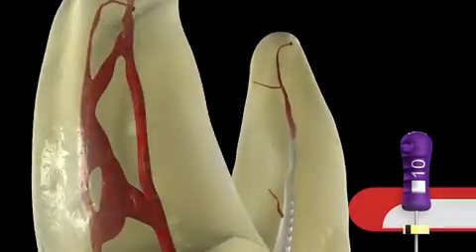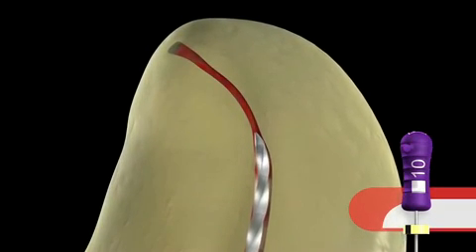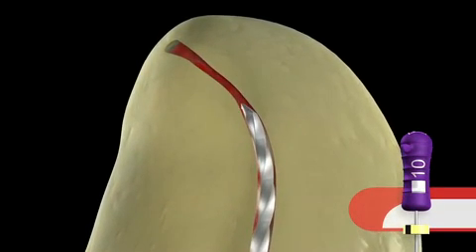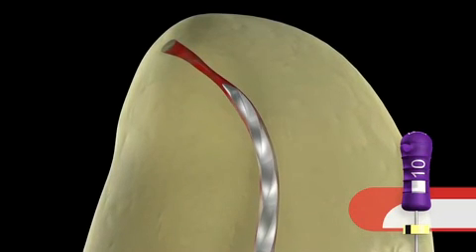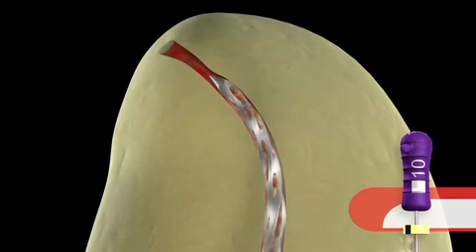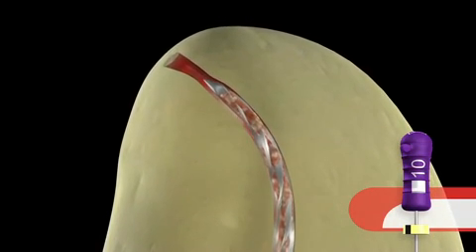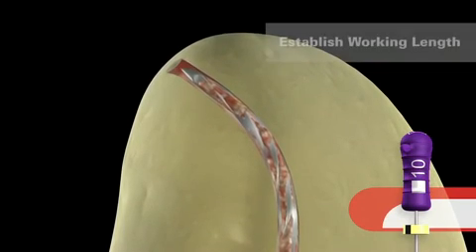Remember, the viscous chelator will be picked up on the file flutes and dragged down into the critical zone. Reciprocate the handle in very short angles back and forth. That draws the file in. When you see the rubber stop about one or two stops off your reference point, no more reciprocation, simply slide.